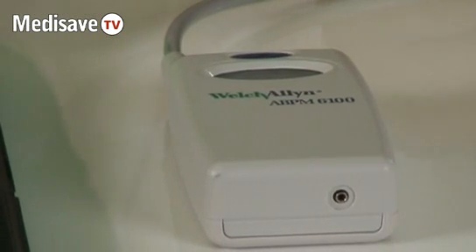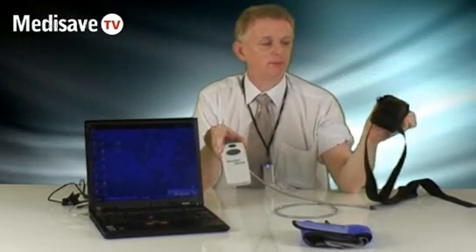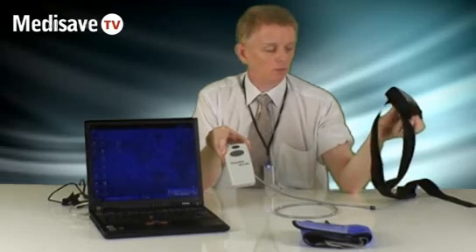It's worn during the test in this black case, which can be worn with a waist belt or a shoulder strap if you prefer. Both come with the unit.